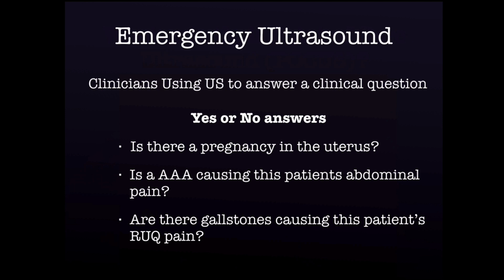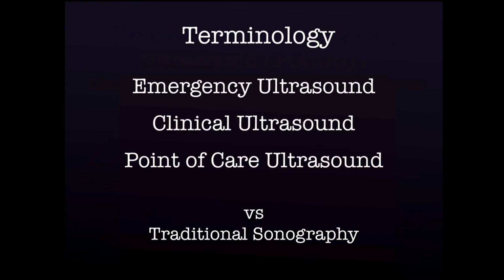And that's the way a lot of this started out, and that's the way a lot of clinicians still use ultrasound in their clinical practice. There's a lot of terminology, and it gets kind of mixed up. What I just told you was really emergency ultrasound. You're using ultrasound at the bedside for that emergency patient. But it's really grown past those yes or no answers and out of just a pure emergency diagnosis. And we really talk about clinical ultrasound or clinician-performed ultrasound. And that's the term I really like because all of us are clinicians, or we will be clinicians, and we use ultrasound, and we probably use it a little different way, each one of us, and that's okay, as long as it's making us better doctors.